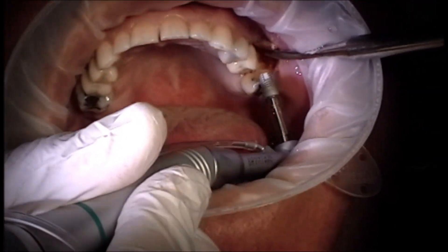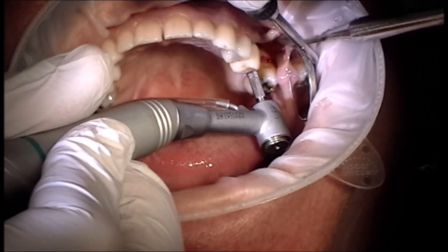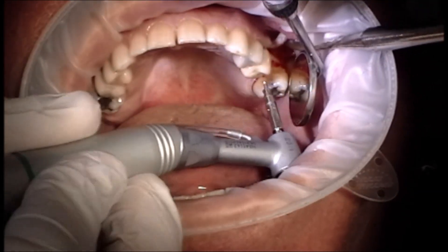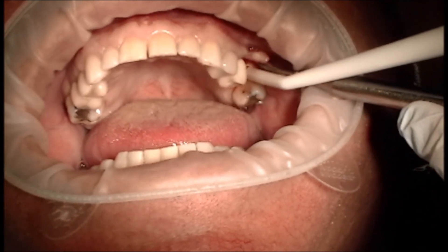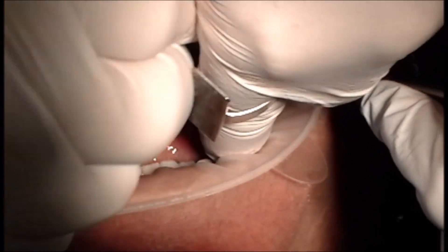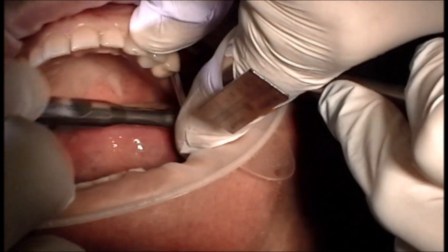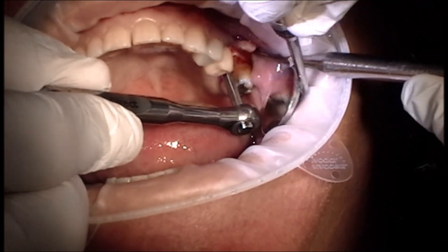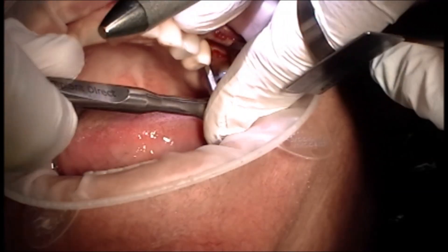Now it's time to place the implant. This is a Blue Sky Bio Max 5x8 implant. I've got my handpiece set on 40 Newton centimeters of torque. As I begin placing it — right there it torques out and I'm only about halfway seated. So at this point I had to get my hand ratchet out and seat it the remainder of the way. This had really high initial stability — I would bet it was probably up around 70 or 80 Ncm. Just hand ratchet this in until it's at your desired vertical height. I planned this to be about a half to one millimeter subcrestal. Take a look and make sure that you're not going too deep or too shallow, give it a couple more turns, and that should complete the placement of the implant.